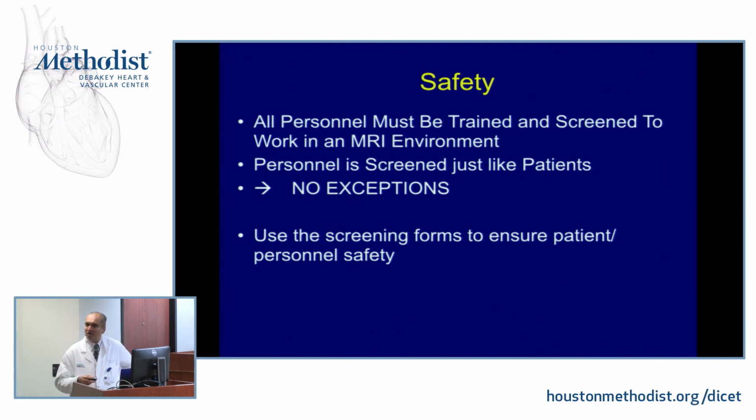The other thing to be aware of is those credit cards that we have. They have a magnetic swipe on the back, right? Well, what do you think happens to that magnetic swipe when it goes into a magnetic field? It gets lost, right? So if you're getting an MRI or you're in the lab rotating and you go in with your wallet, you can be assured your credit cards are all going to get declined. You're not going to be able to buy anything that weekend. So again, make sure you leave your wallet outside the door unless you actually want to give up your credit cards for a few days.